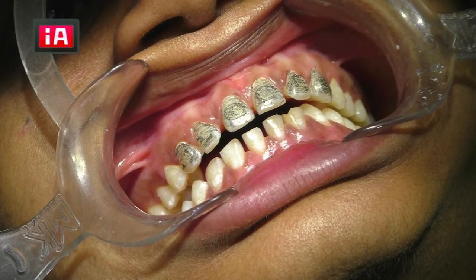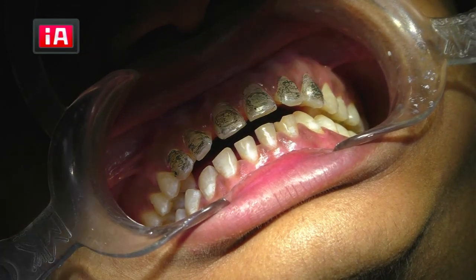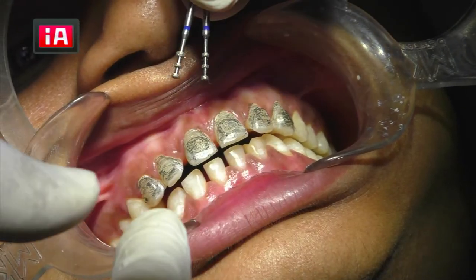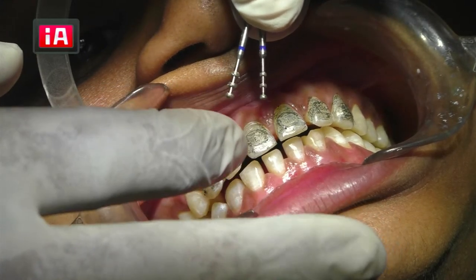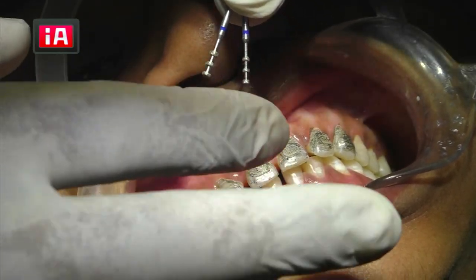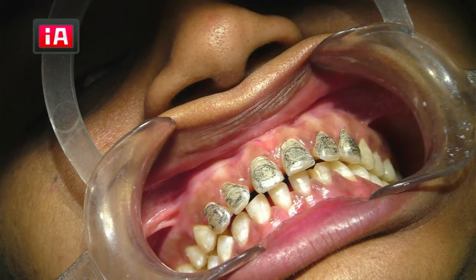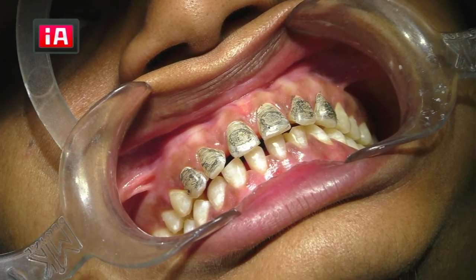Now we have certain markers, depth cutting burrs. There are two depth cutting burrs. You can see here, I don't know whether it is visible or not, okay, it's seen. One has a very minimal depth, the other has more. This one is for a laminate, with less cutting, and the other is for a veneer where you want to cut more. I'm going to use the one that cuts very less, to manage the depth. So how do we use these depth cutting burrs?